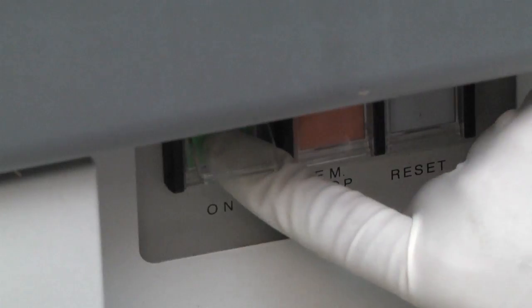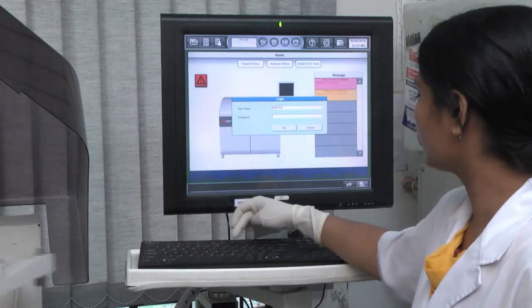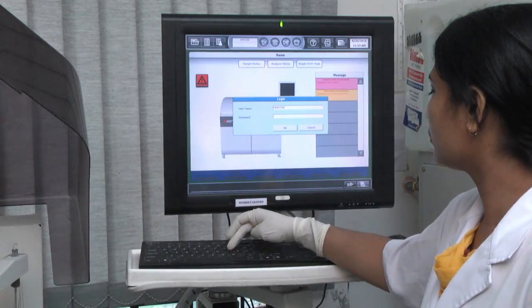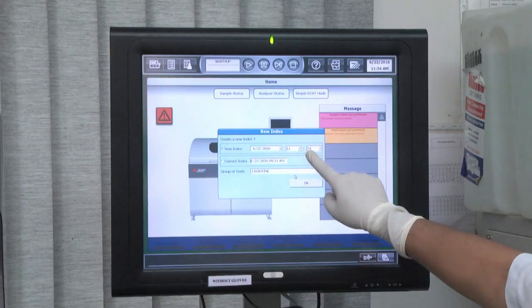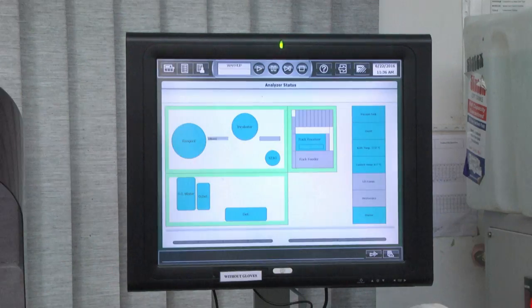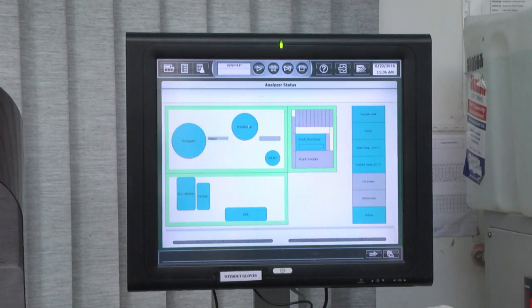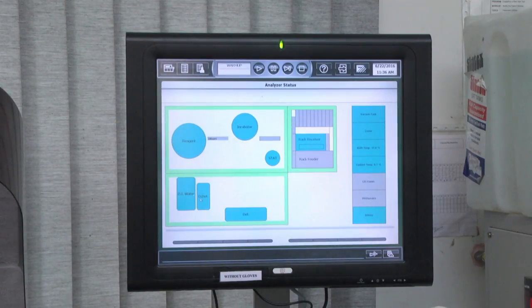To set start conditions, start the analyzer by switching it on. Once the computer screen opens, feed in the username and password, the date and time of running the test, and the operator name. Check the temperature of the reagent compartment and the cuvette. Check the supply of distilled water. Anything out of normal will be indicated by a color-coded alert button.